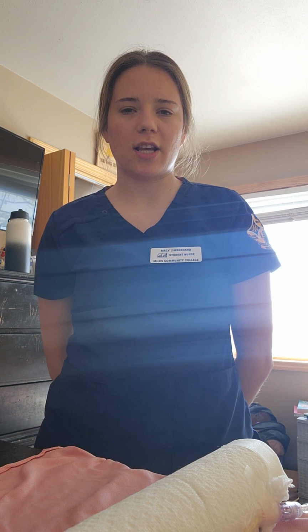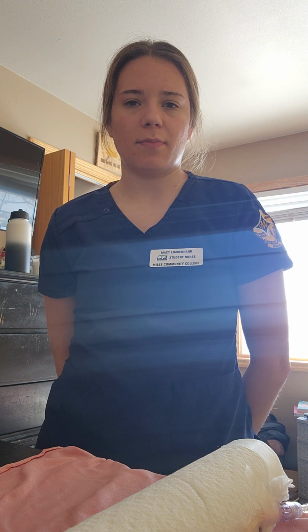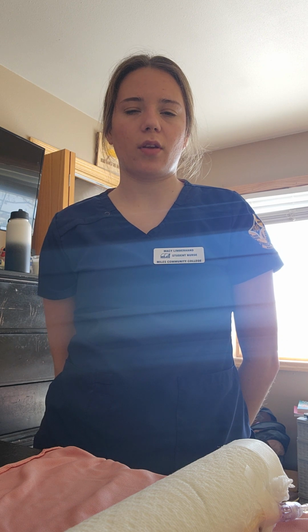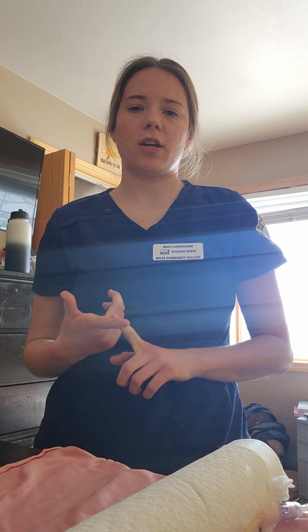I'm a student nurse, and today I'm going to be demonstrating how to set up an IV Piggy Back. The first thing I'm going to do is list off my 6 rights of medication administration, which is right patient, right medication, right route, right dose, right time, and right documentation.